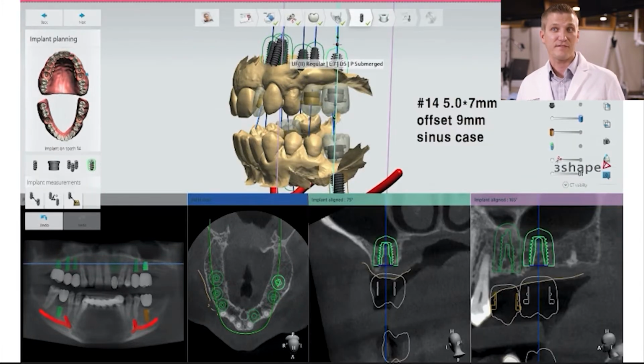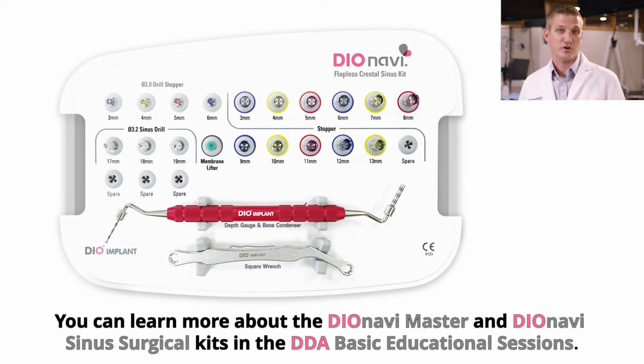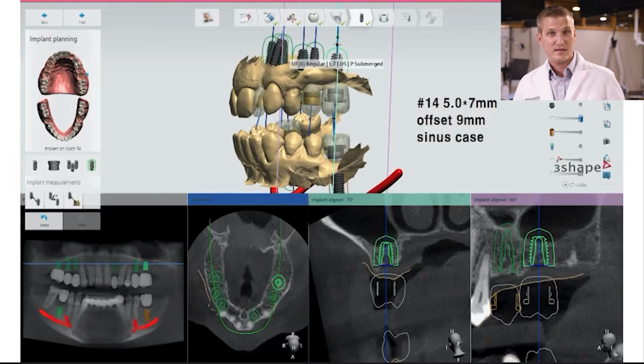Number 14 is a 5x7 right now, and like I said, I think we're gonna do at least an 8.5, maybe even a 10. We'll see how it goes in surgery. But you can see that implant is planned beautifully relative to the prosthetic tooth. You see it's just barely jumping up into the sinus, and that's when we're gonna use the sinus kit with the master kit. We're gonna jump up into the sinus, graft it with some synthetic bone, and then create vertical space for a longer implant. So that's our surgical plan for today.